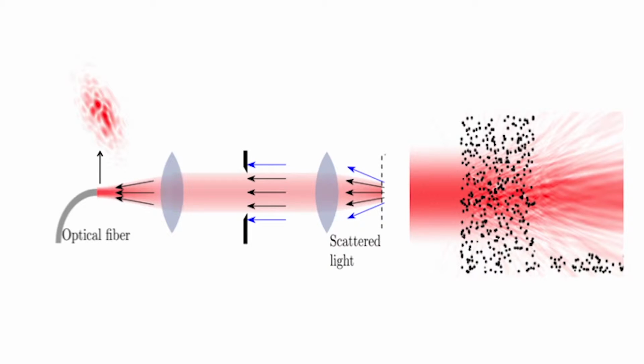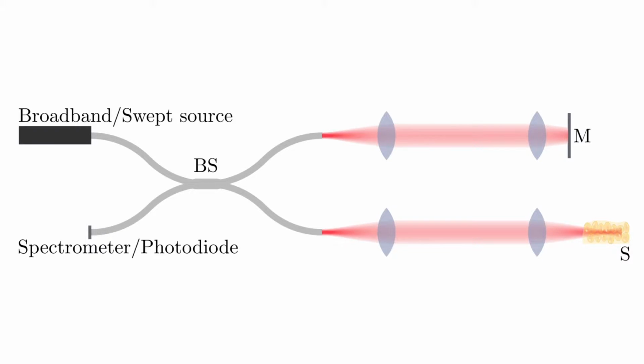So one of the reasons why OCT images can be hard to interpret is that the eye has many structures which are of a similar dimension to the wavelength of the light used to image them. This is a problem because when light travels through any kind of medium that has structures which are of a size similar to the wavelength, then the light can propagate in a rather complicated way.